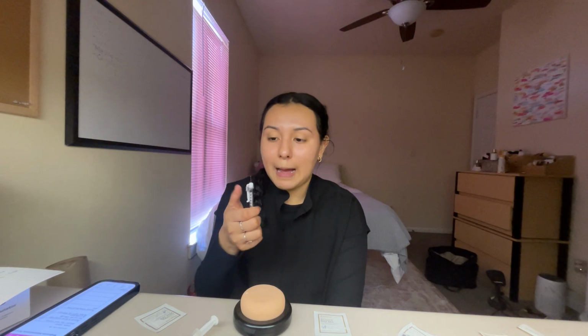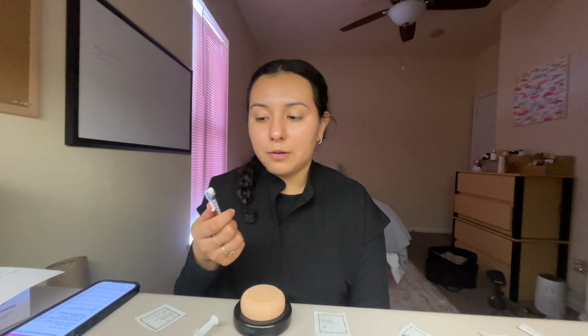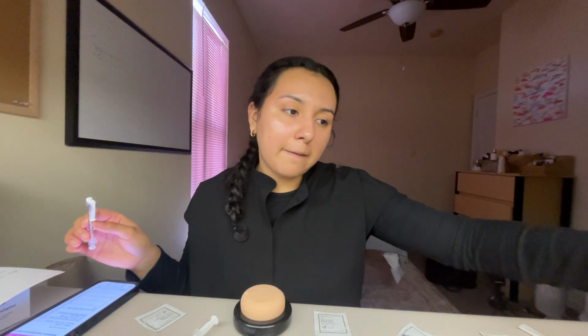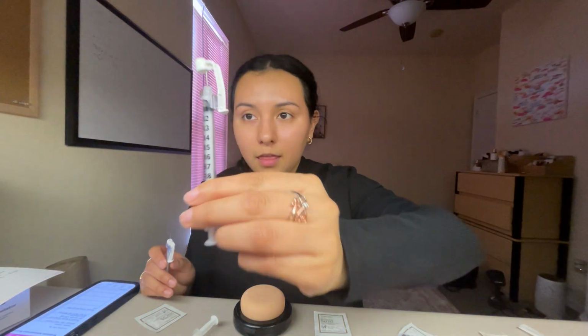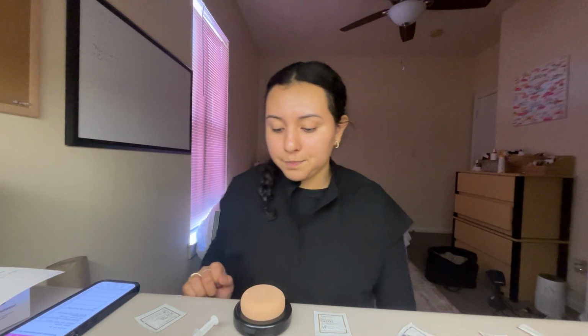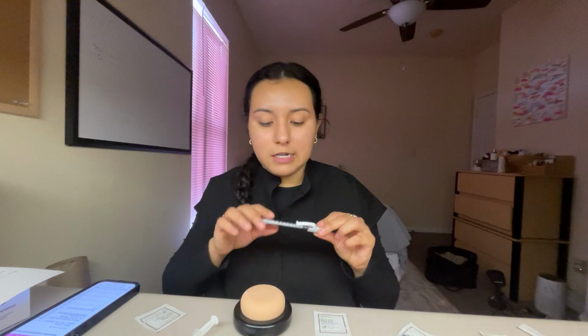Alright, now that that's done, I would cap my safety gear. So I would safety gear it with one hand, and then I would place it in my sharps. So it would look like this. So I would hypothetically do that. And then next up is my TB skin test.